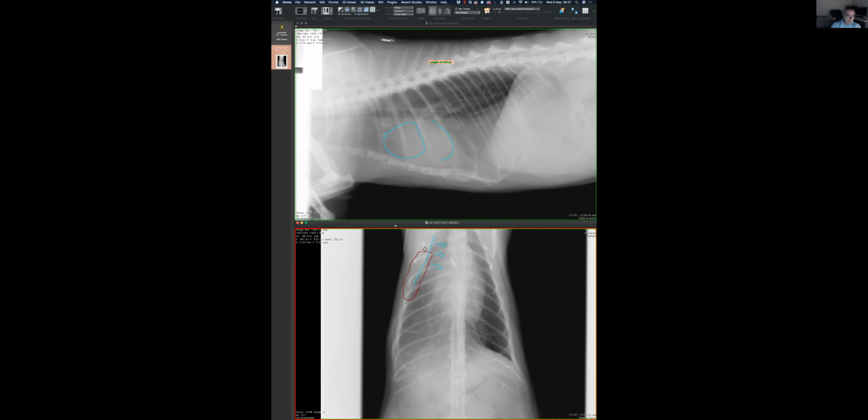But then, if that is the case, why can we see the caudal contour? What is not fitting is, if this is pleural effusion, like a pocket of pleural effusion, makes sense? And I'm saying pocket because it's not evenly distributed. It's just kind of cranial. If we have that as fluid, and we use that fluid to justify our inability to see the contour of the heart, then by the same argument we should not be able to see the caudal contour of the heart. So what is in contradiction here is not the idea of a pleural disease, but the idea of fluid in the pleural space that is somehow behaving like fluid here, but not behaving like fluid here.